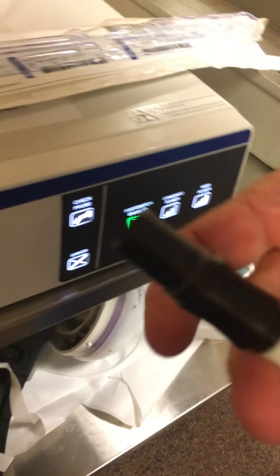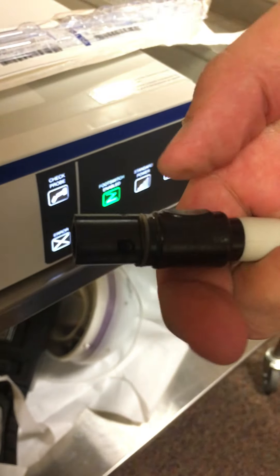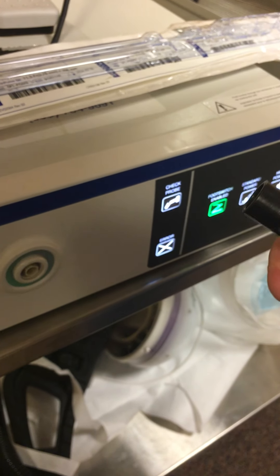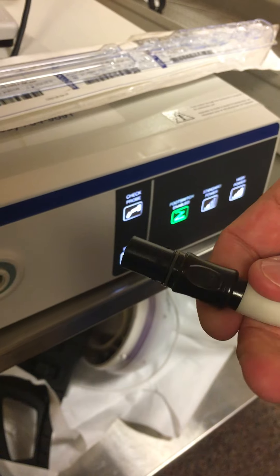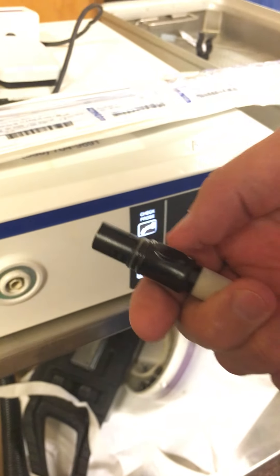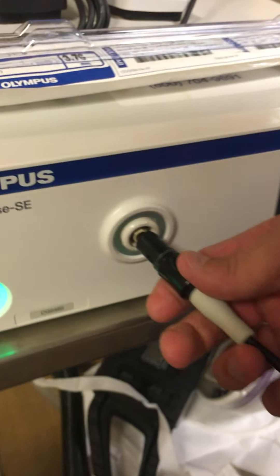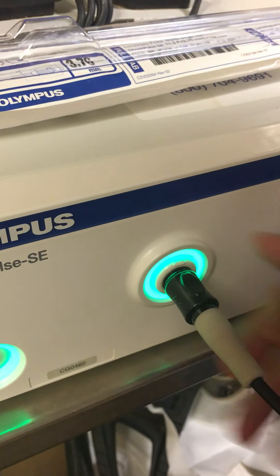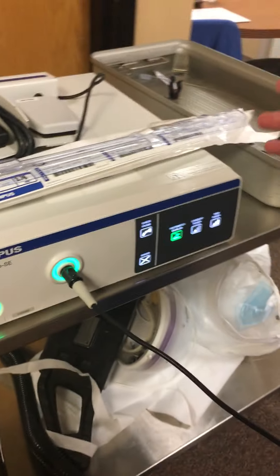Pass this end off to the circulator. On this end there's a flat portion — that's the end that goes in at the 12 o'clock position, on the upside. There's only one orientation it fits, so push it in and the green light will illuminate solid. Now we're ready to go.